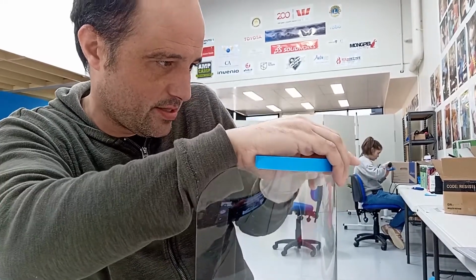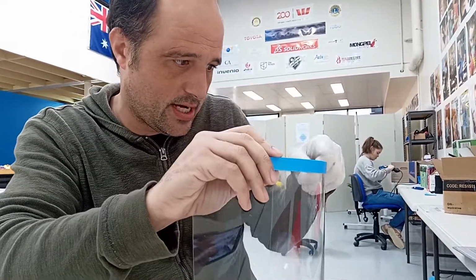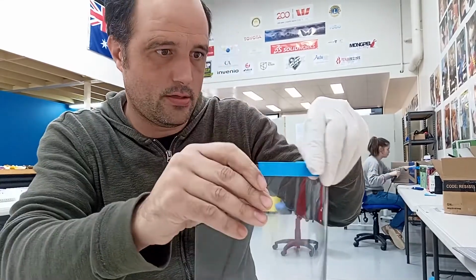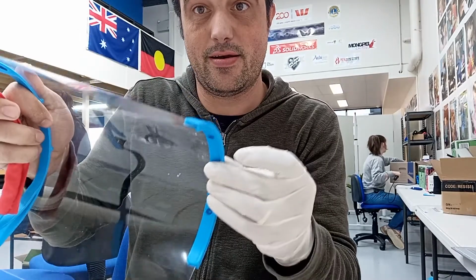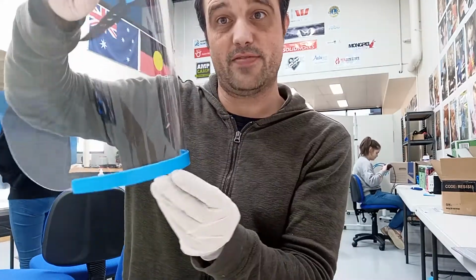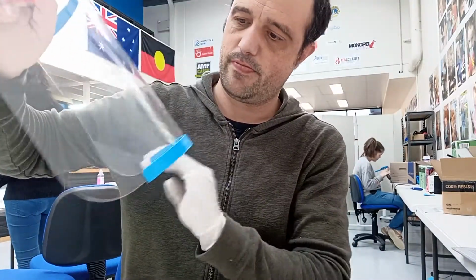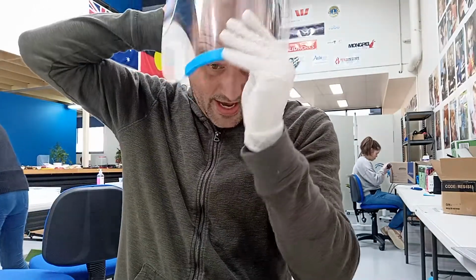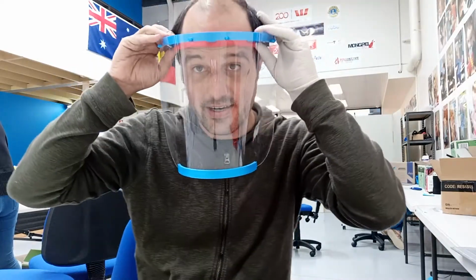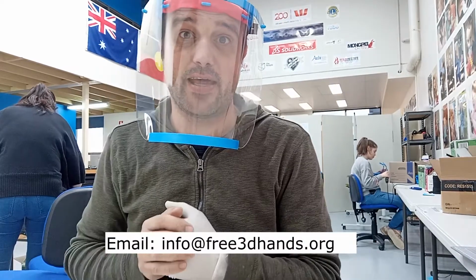There we go, and the last one, you should hear a little click. There we go. So that's not going anywhere. Locked into place, and it gives the bottom a much nicer profile. How's that? Much better.